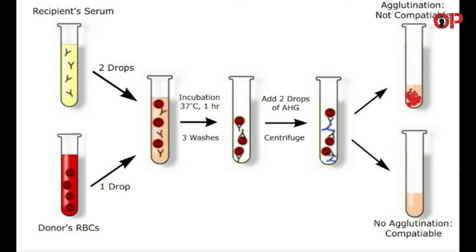Decant the serum completely and wash the cells three times in saline. Add two drops of anti-human globulin (AHG) and mix. Allow to stand at room temperature for 5 minutes.